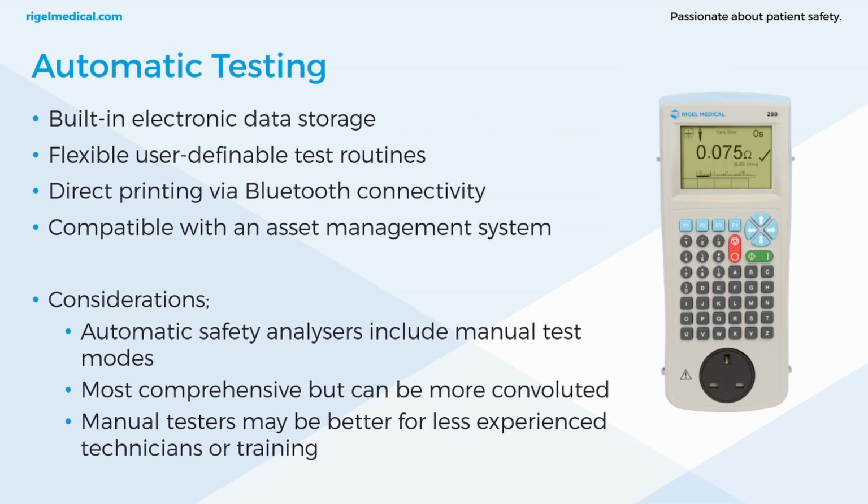However, automatic testers are often needed. This is because they have built-in electronic data storage, flexible user definable test routines, so automatic test sequences, direct printing via Bluetooth connectivity, so your pass-fail labels, most commonly used, printed. You can also print results. Also compatibility with an asset management system.